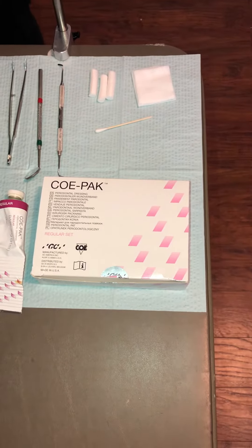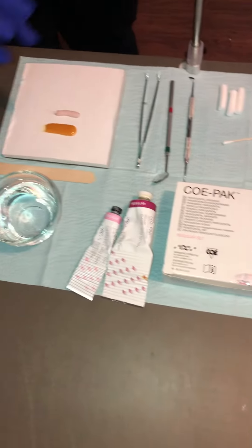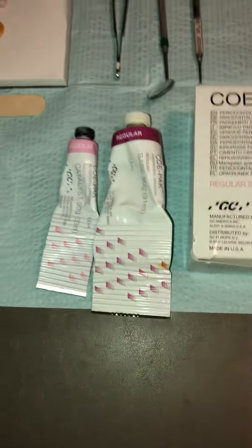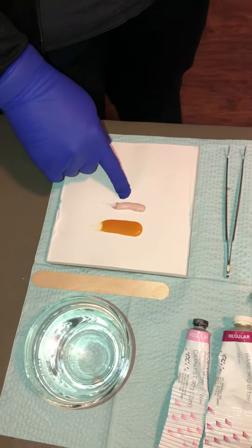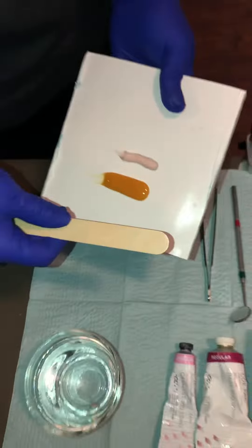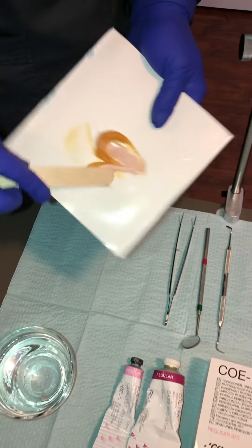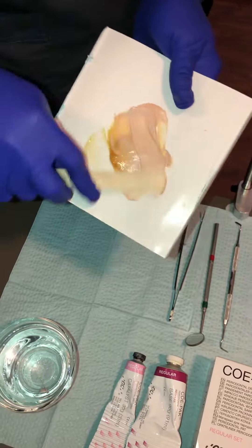I'm going to show you how to mix up the Coe-Pak, or the periodontal dressing. This is just a brand, a pretty common one. You would dispense equal lengths of each of the base and catalyst. I'm going to mix it with a tongue blade, because this material can be very, very sticky if you were to use a metal spatula.